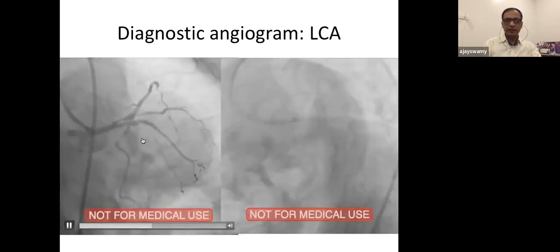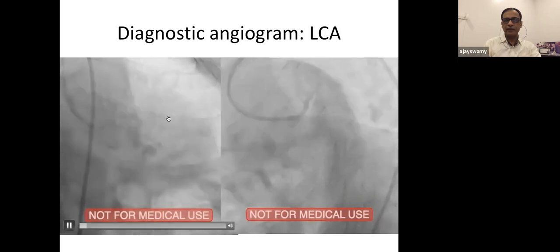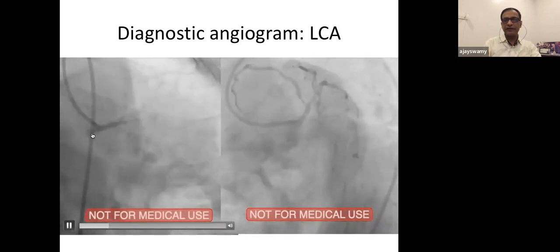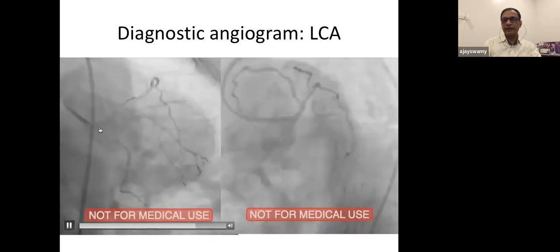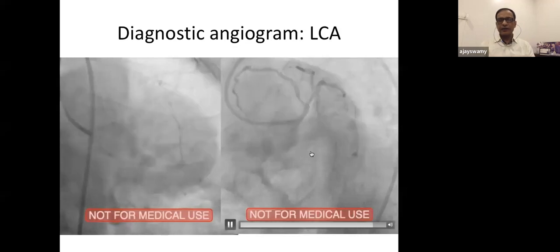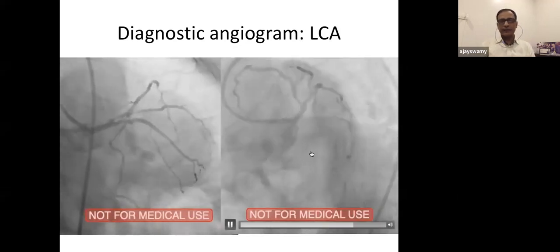And this is what the angiogram showed. You can see that there is a subtotal occlusion of the proximal LAD and a little bit of calcium that you can see above the distal left main in the caudal view, although this is an AP caudal. And the operator thought this is not a problem and we will do an LM-LAD crossover.